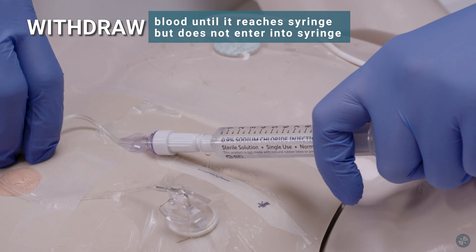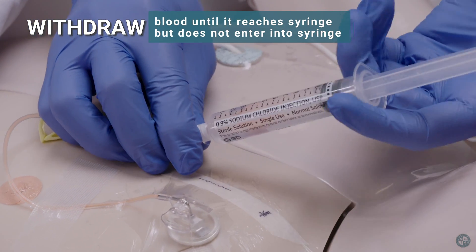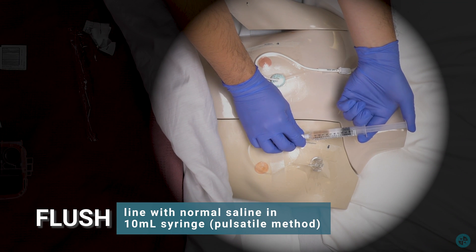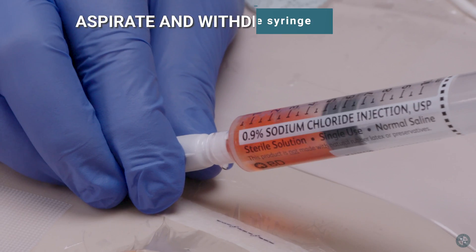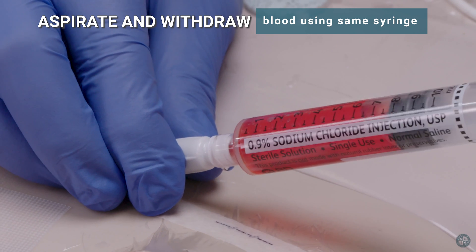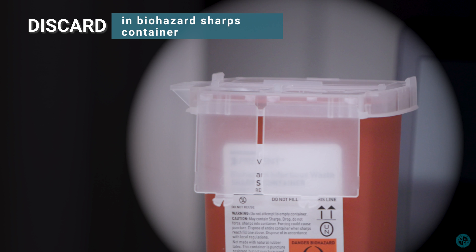Withdraw blood until it reaches the syringe but does not enter into the syringe. Flush the line with normal saline in the 10 milliliter syringe. Aspirate and withdraw blood using the same syringe, then discard in the biohazard sharps container.